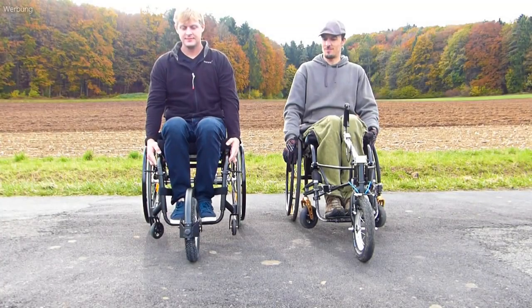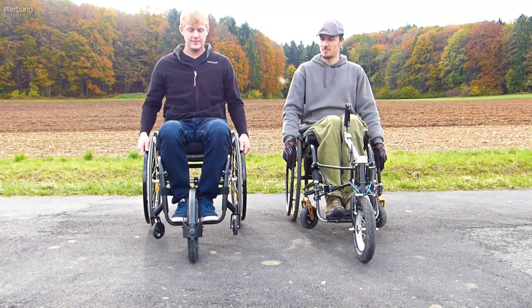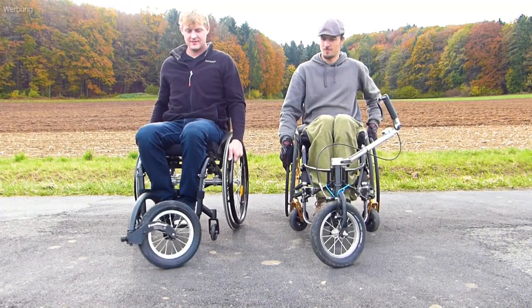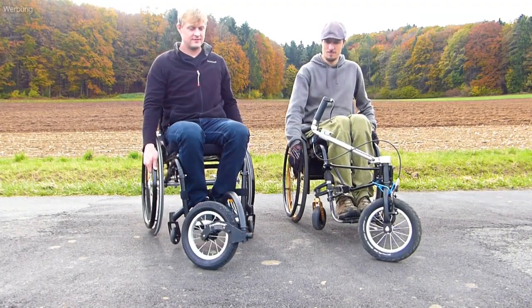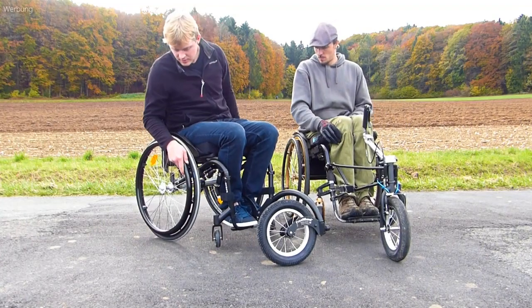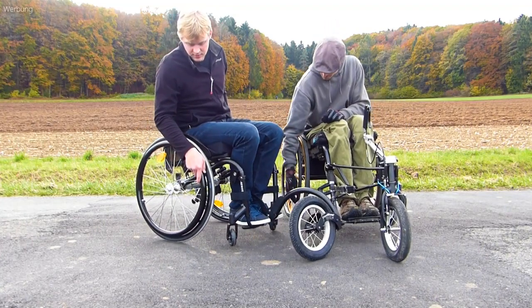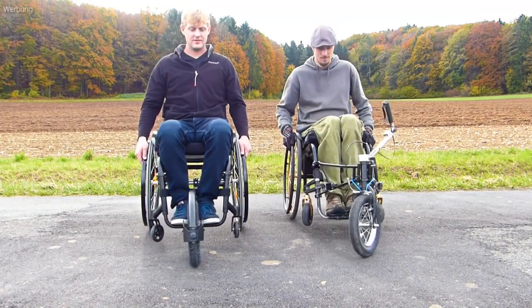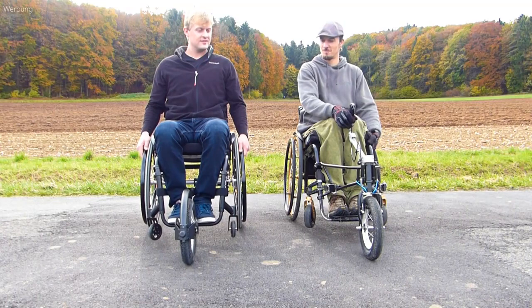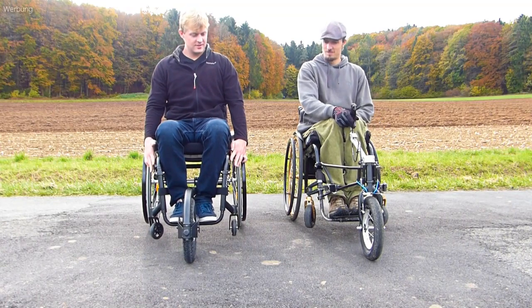If you look at the function of the attachment wheels, they can both be steered over the hand rims as usual. Here on the left, the front rollers when turning come closer to the ground, which doesn't happen on the right side. In addition, the Fossara can also be steered directly with the handlebar.